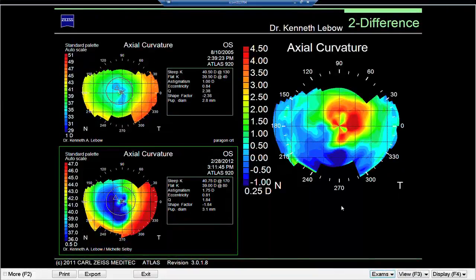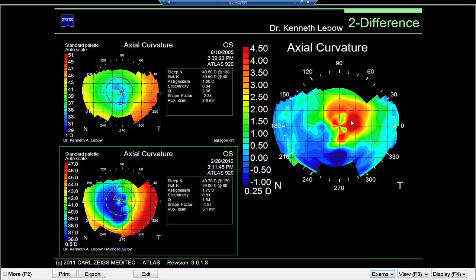What you see on the computer are two images — August 10th of 2005 and February 28th of 2012. You can see that there are some changes in the shape of these two images as demonstrated by the difference map on the right. The area of red shows steepening relative to the two maps in this area, and flattening below that. Clearly there's been an influence of the contact lens on this eye over a period of time.